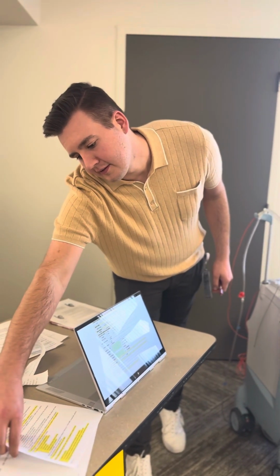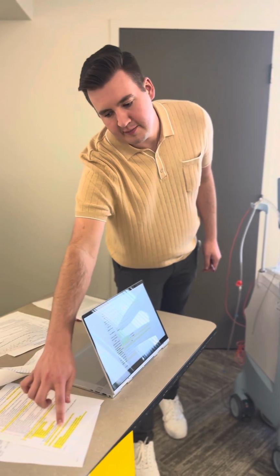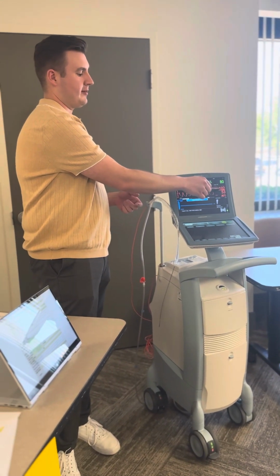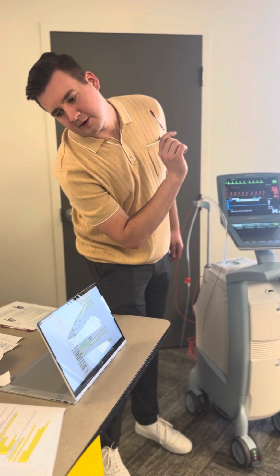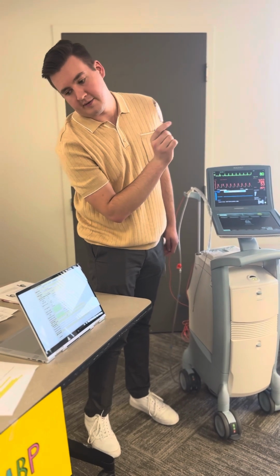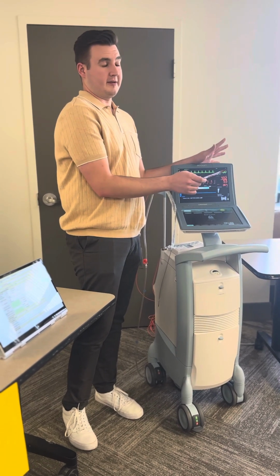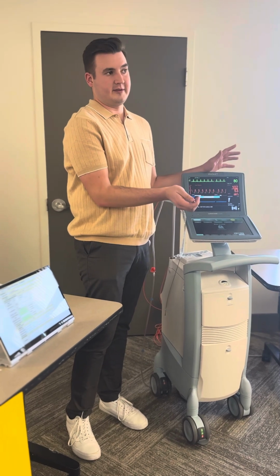There's also, in our policy, it's built in to notify the physician for urine output. If your augmentation is only 5 less or 5 above the systolic, then you need to page the doctor as well. So it was 14 and this was in the 90s. That's good. But if it's only 5 above, it means for some reason it's not working as much as it needs to.